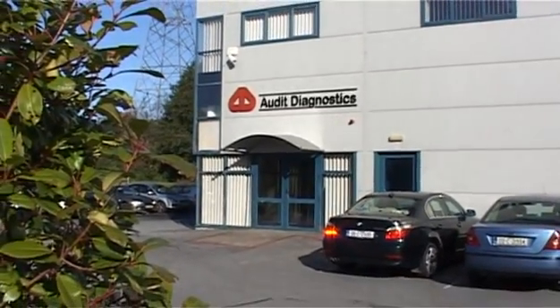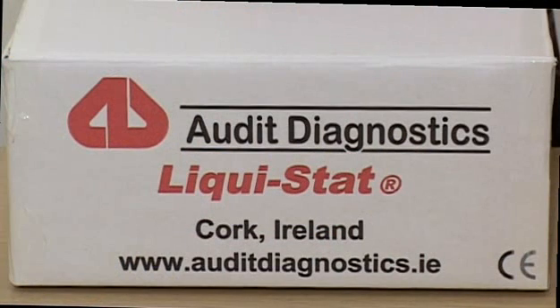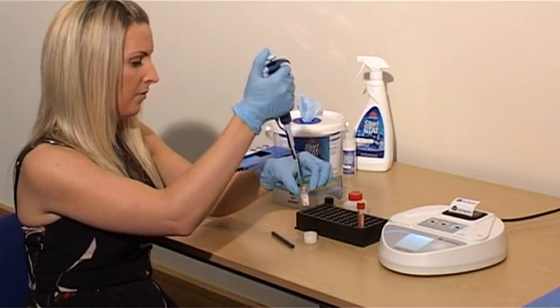Welcome to the Audit Diagnostics Liquistat training video. The Liquistat is very simple to use. By following the instructions on the screen and adding the sample to the cuvette, you can easily operate the system.